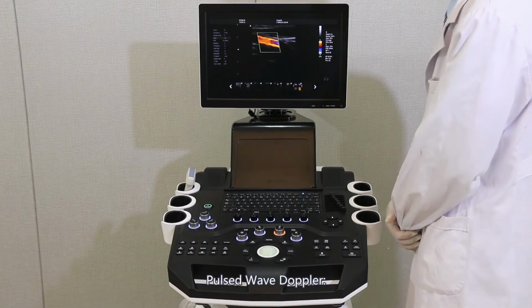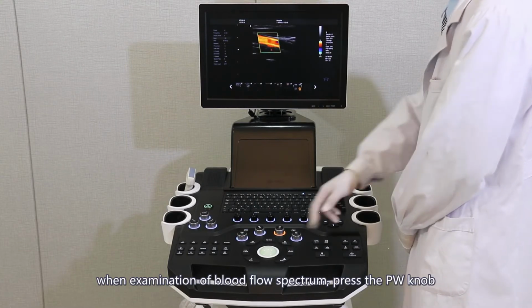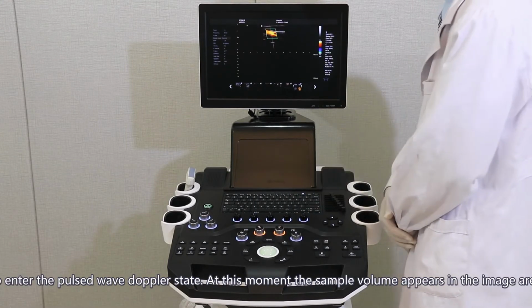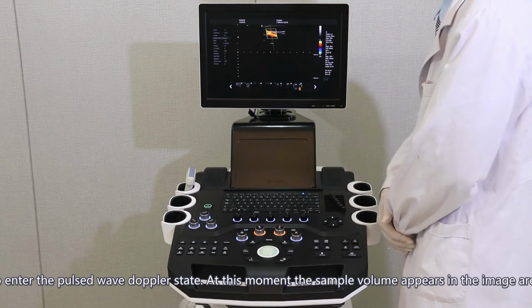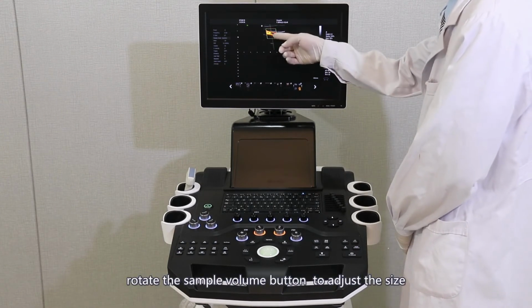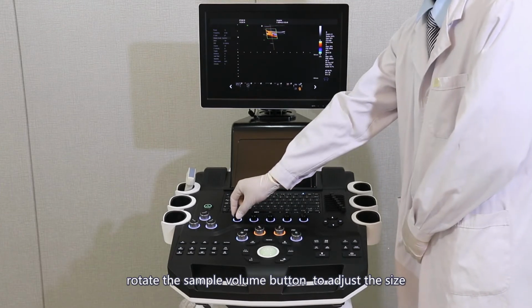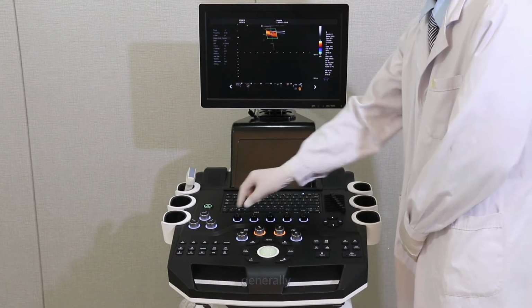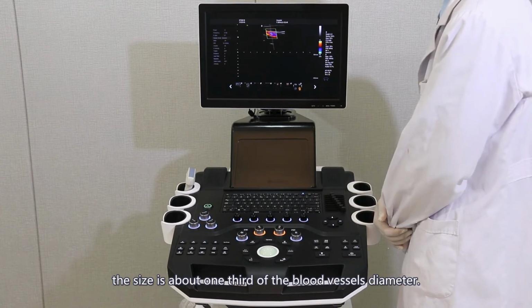Pulsed wave Doppler. When examining the blood flow spectrum, press the PW knob to enter the pulsed wave Doppler state. At this moment, the sample volume appears in the image area. Rotate the sample volume button to adjust the size. Generally, the size is about 1/3 of the blood vessel's diameter.